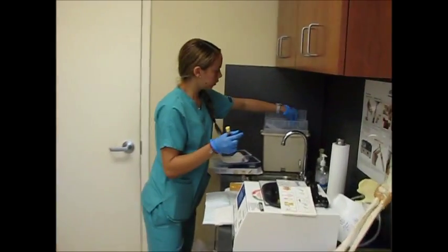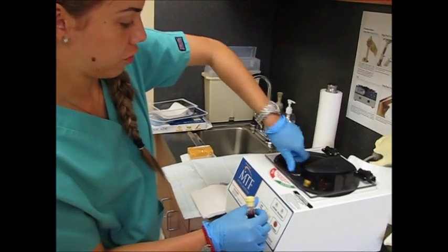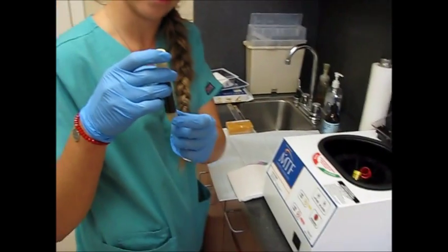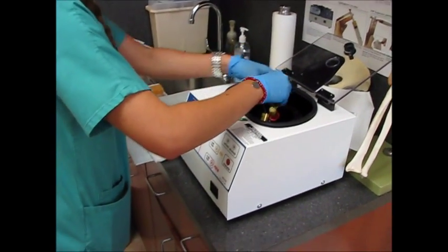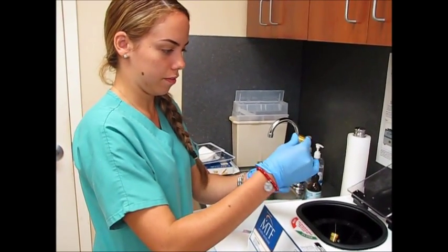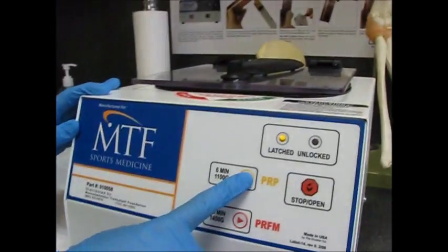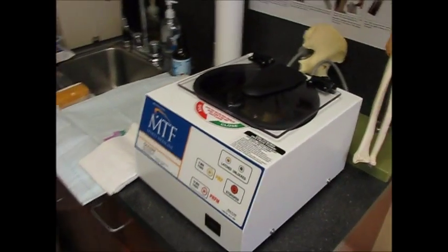So they're taking the patient's blood and spinning it in a centrifuge — but it's a specific one for this, not just any lab centrifuge. That vial already had anticoagulants in it, and it has silicone which separates the plasma from the blood. Then you spin it and draw the plasma back out — six minutes at 1100 RPM.